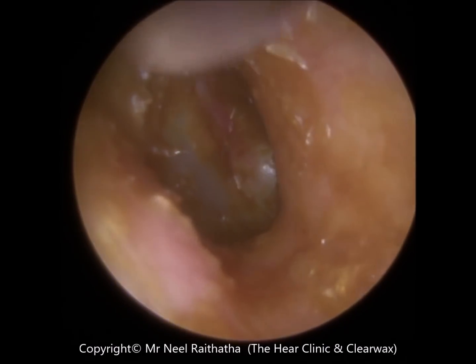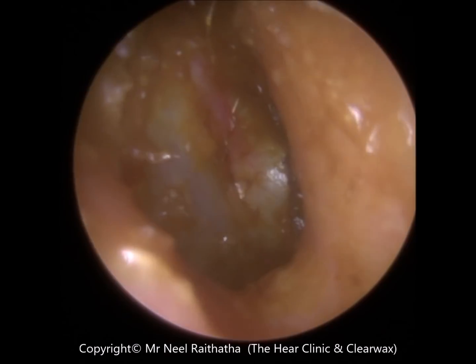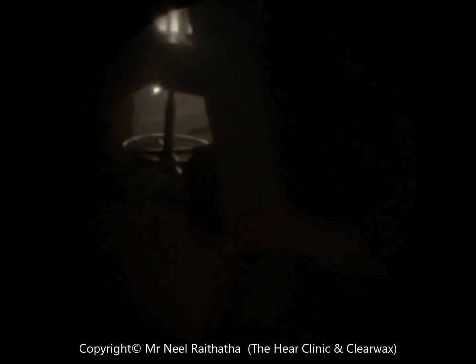I can see you flinch there. It's me being a baby, I think. It's a very sensitive part of the ear — we're just not going to be able to get that; it's stuck in that anterior recess. Let's hope it just goes away. I can hear it now — you're hearing better on that side. When we go in with a suction probe it can cause what we call a temporary threshold shift — because it's quite noisy, it can momentarily reduce your hearing. It's pretty good now, more balanced. So it was just the suction probe reducing your hearing temporarily and it's come back. But if your hearing gets worse we'll have to talk about hearing aids — it may be that you've got an underlying hearing problem, because the remaining bit of wax on that eardrum shouldn't really affect your hearing. I'll show you on the video what we've done. I'm really pleased with that.